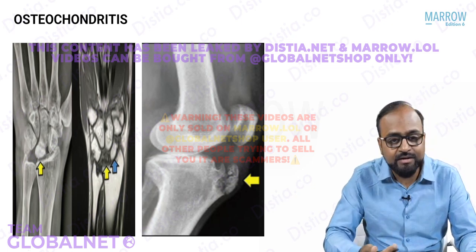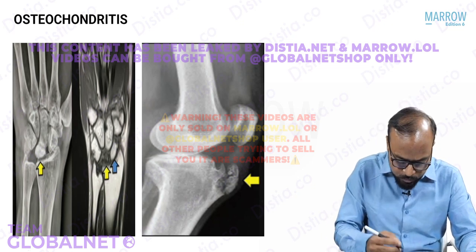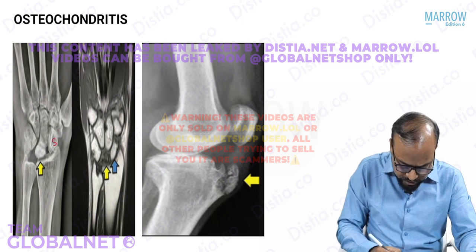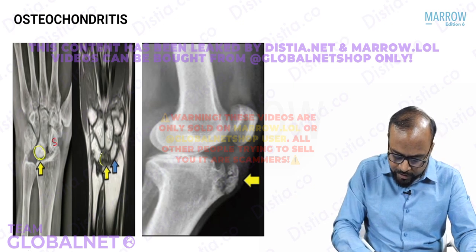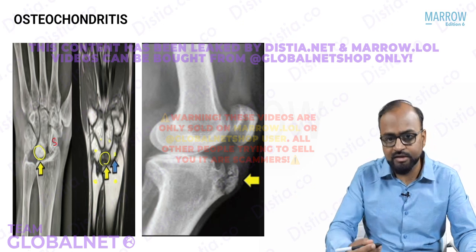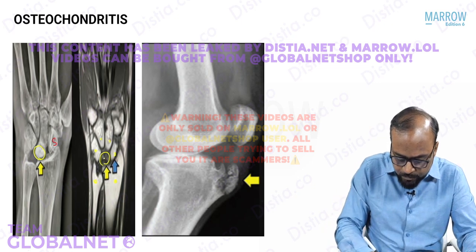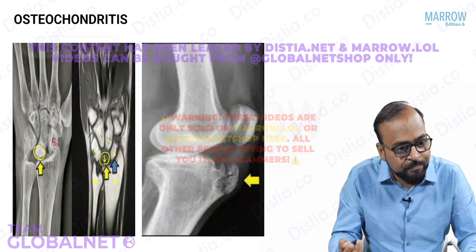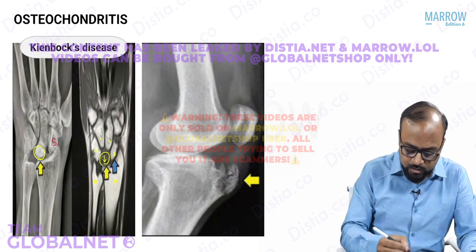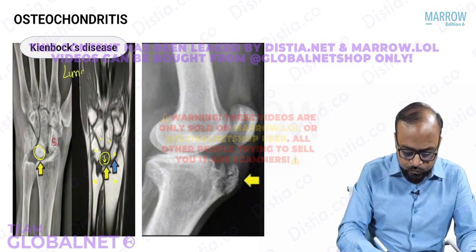So if we see that a lunate bone is involved, so proximal row of carpals includes what? Scaphoid, lunate. Just alongside the scaphoid you see a sclerotic lunate, right. You see on MRI it appears hypointense. Bone marrow is usually hyperintense because of the fat that it contains, right? But when it loses it, it gets infarcted, it appears hypointense like this. When the lunate is involved, this osteochondritis is given a name. It is called Kienbock's disease. So Kienbock's disease is what? It is osteochondritis involving the lunate.